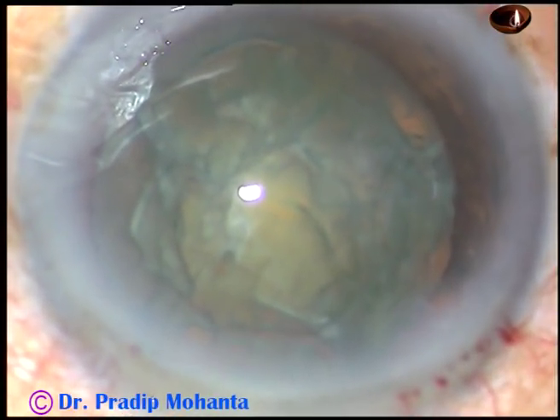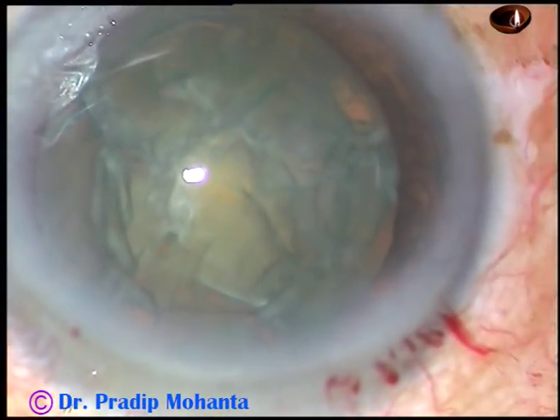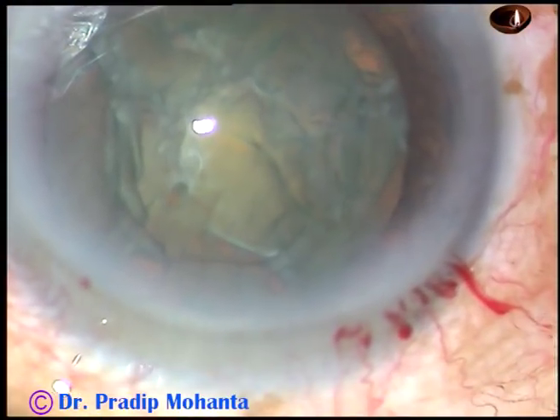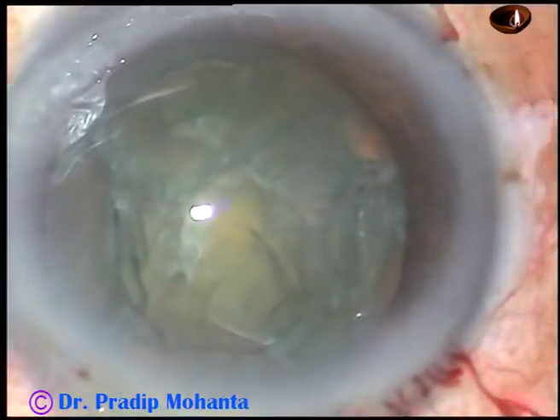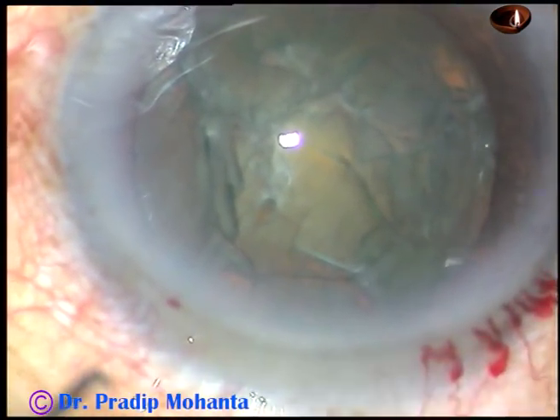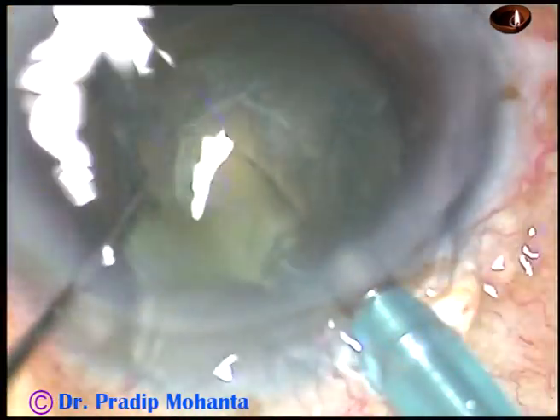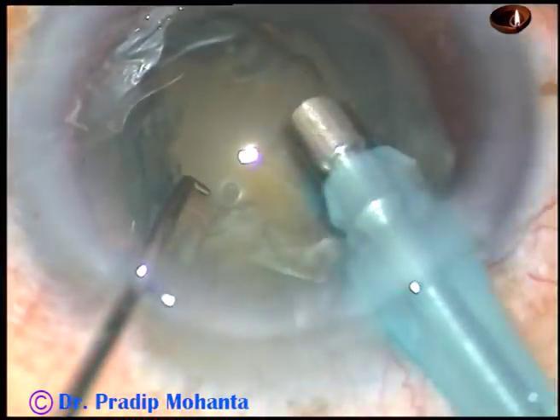Now inject viscoelastic substance. And now is the time to introduce the tip of the phaco handpiece. The machine being used in this case is Oertli Cataracts 3 — you can use any machine, you just have to know the machine. I am just removing some superficial cortex.